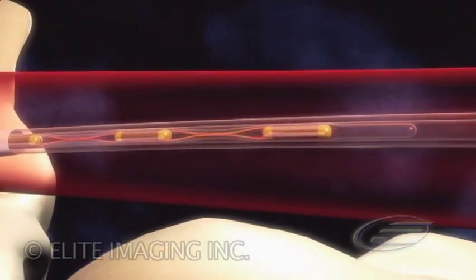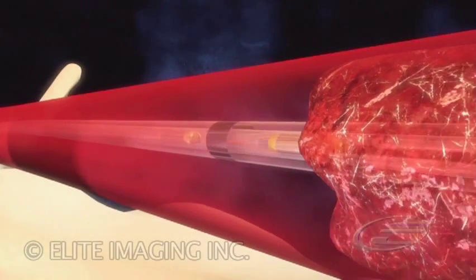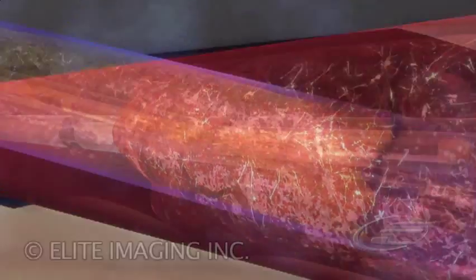The lysis ultrasound core, containing multiple ultrasound transducers, is gently inserted into the drug delivery catheter.